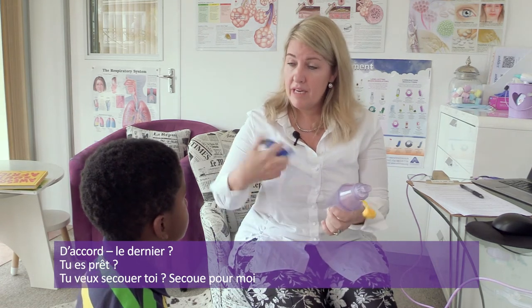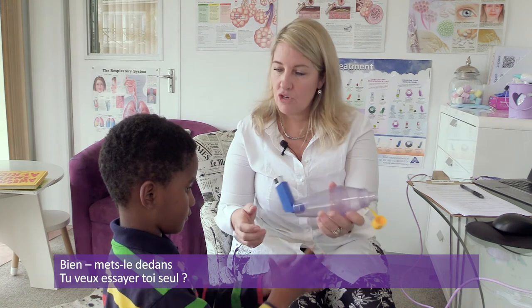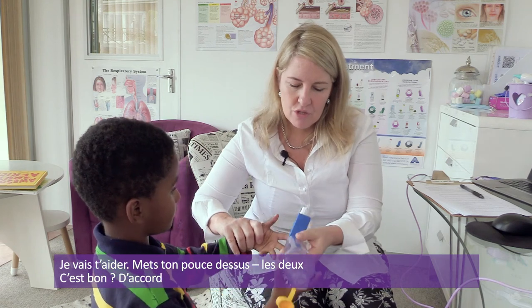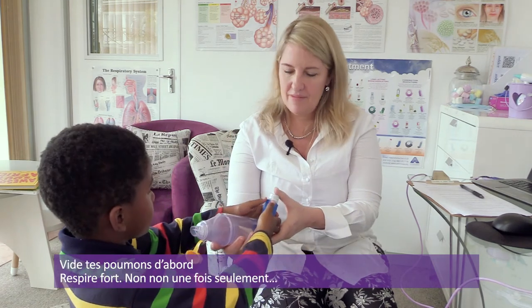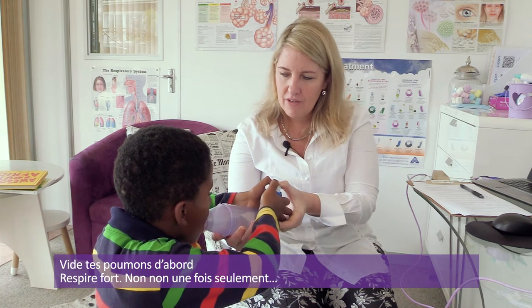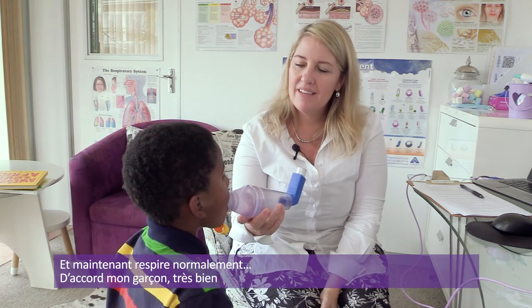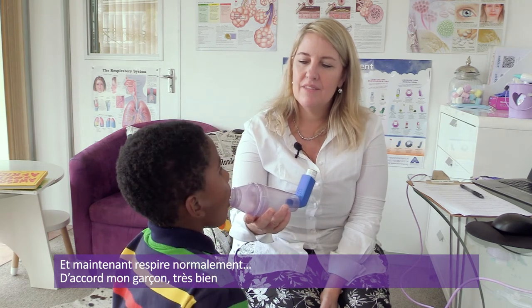Okay, last one. You ready? Shake, shake, shake. Do you want to shake? Shake it for me. Good. Okay. Let's put it in. Do you want to try? Do you think your fingers are strong enough? Okay, I'll help you. Put your thumbs on top, both of them. How does it feel? All right. Okay, breathe out. Okay. Big one? No, only one. That's fine. Okay, take your hands off. Okay, big breaths. In and out. Okay, well done, my boy. Very nice. Okay, good job.